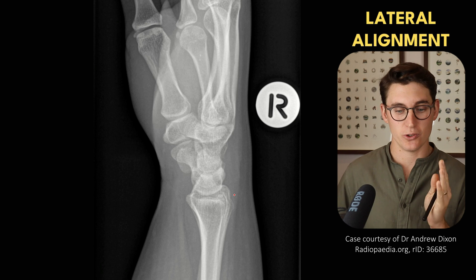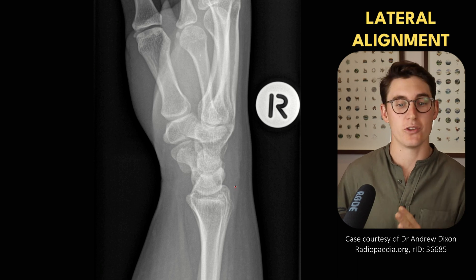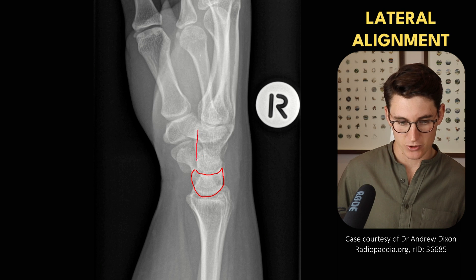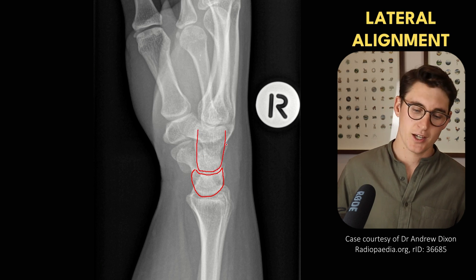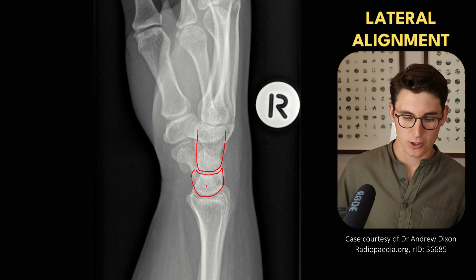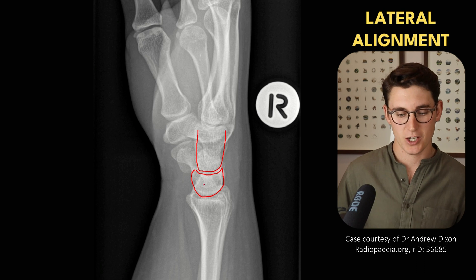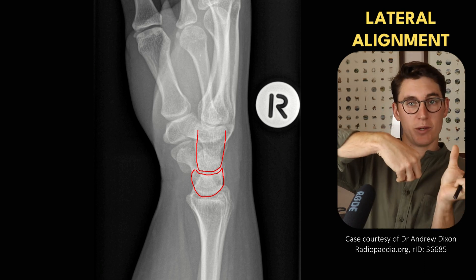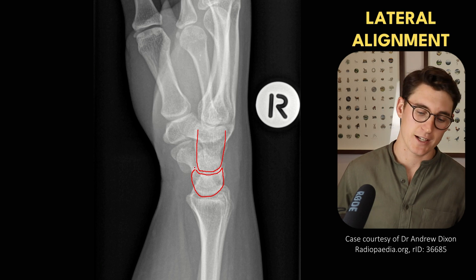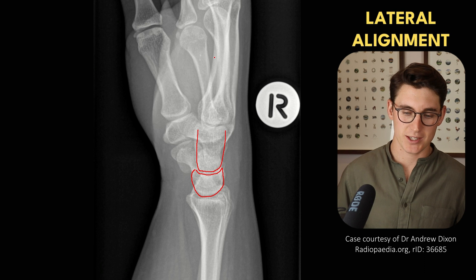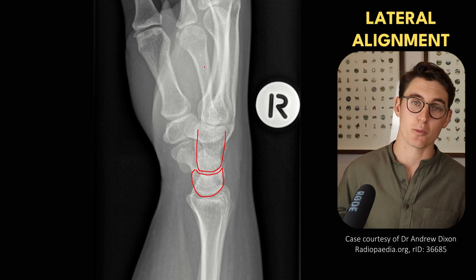Next, we're going to look at the lateral view to assess alignment of the wrist. We can outline our lunate bone and see that our capitate sits nicely within our lunate. We want the capitate, the lunate, our metacarpals, and our radius to be nicely stacked on top of one another. We can have this ball-in-cup arrangement disrupted when we have dislocation of the lunate. It's really important to see that capitate sitting within the lunate, with this line generally well aligned and well stacked.